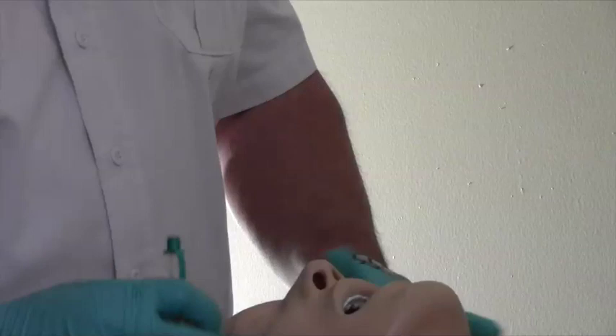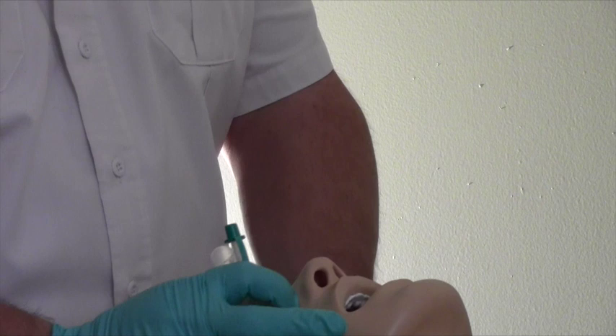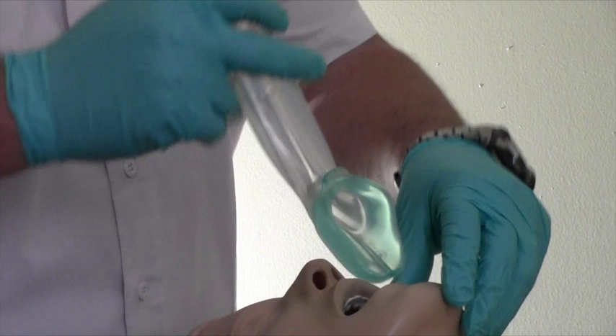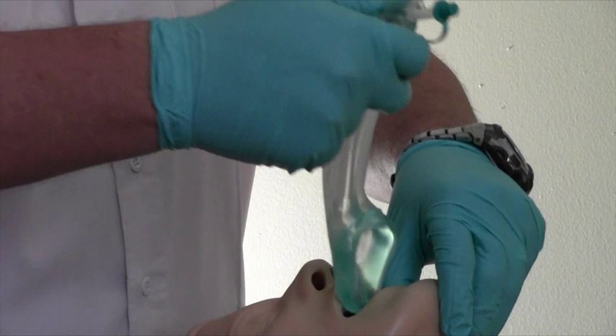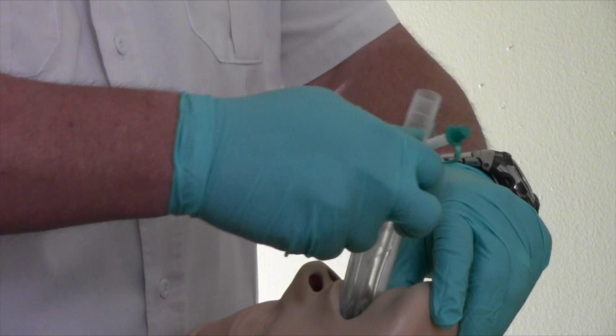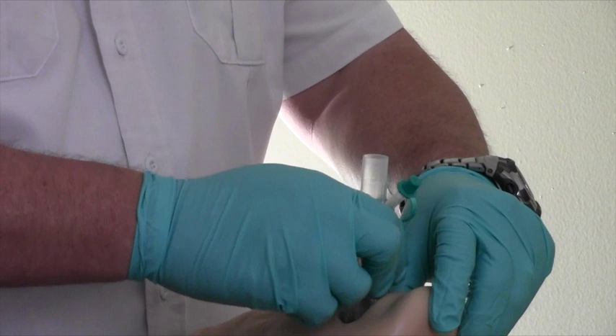IGEL placement in the adult. Step 1: Grasp the lubricated IGEL firmly along the bite block. Position the device so that the IGEL cuff is facing towards the chin of the patient. The patient should be in a sniffing position with the head extended and the neck flexed. The chin should be gently pressed down before proceeding to insert the IGEL. Introduce the leading soft tip into the mouth of the patient in a direction towards the hard palate. Guide the device downwards and backwards along the hard palate with a continuous yet gentle push until a definitive pressure or resistance is felt.